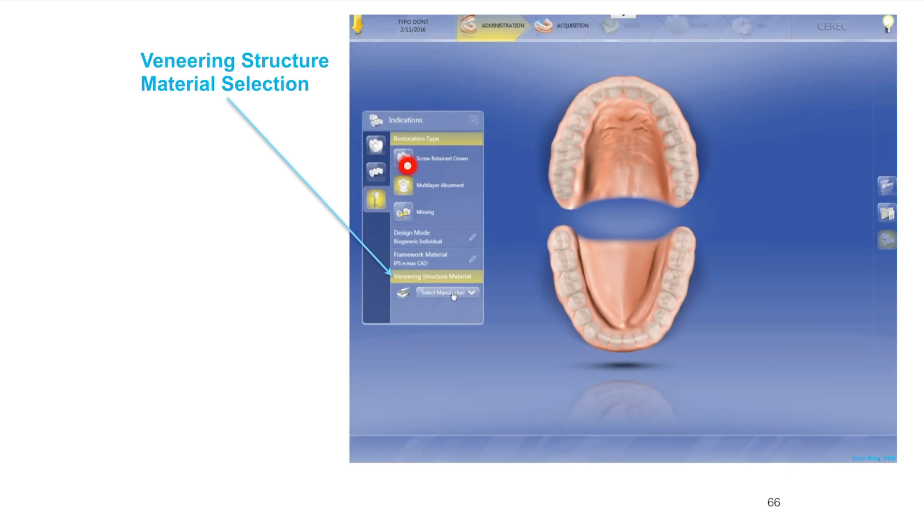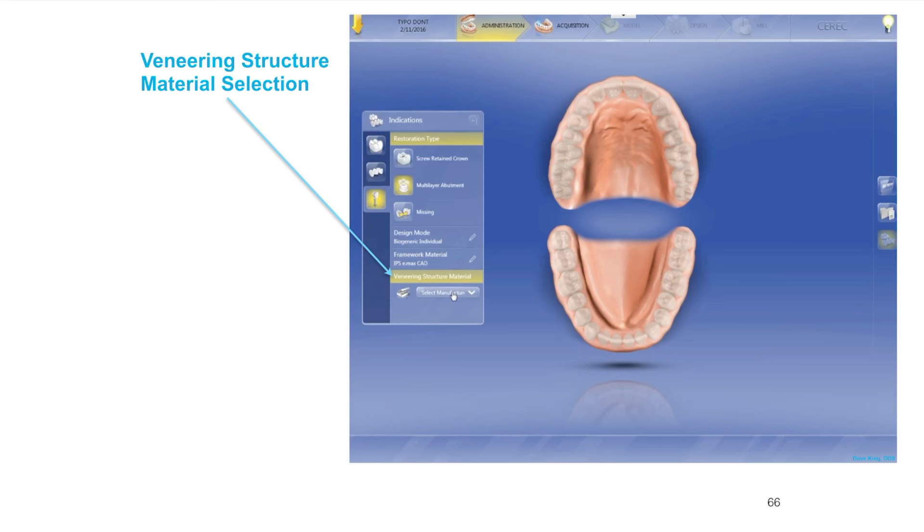We've selected Emax and then the next step is to select our veneering structure. This is assuming we're doing a multi-layer abutment, so we're going to select our veneering structure which is the crown that will be bonded on top of the multi-layer restoration. This doesn't matter, you can select whatever you want depending on your personal preference and the indication for that individual patient.